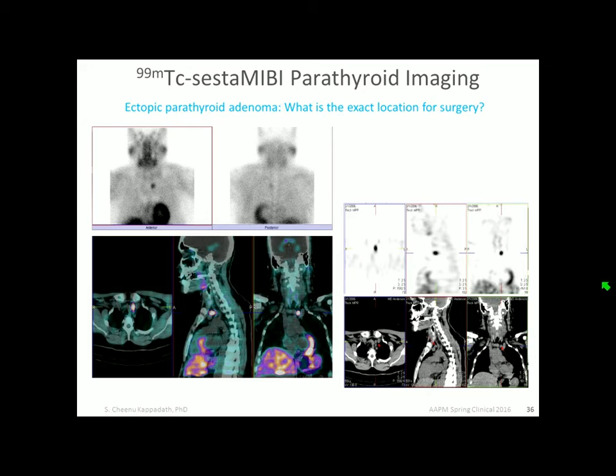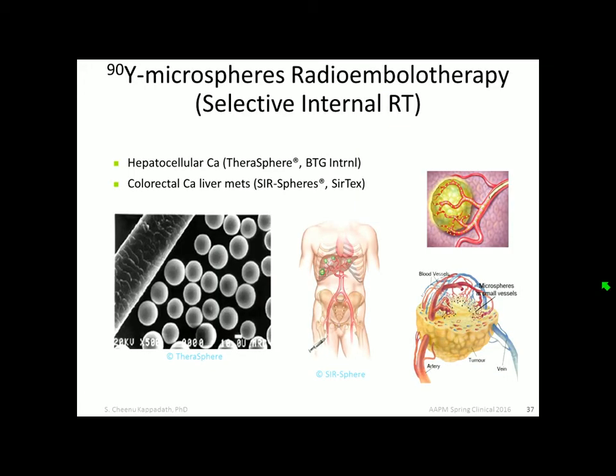So surgical guidance is actually an area where SPECT CT has made some contributions. Another area is yttrium-90 microsphere therapy. This is for management of liver diseases. There are a couple of approved devices out there.